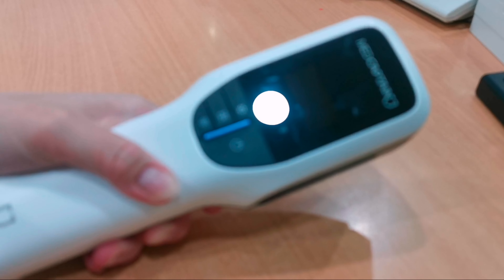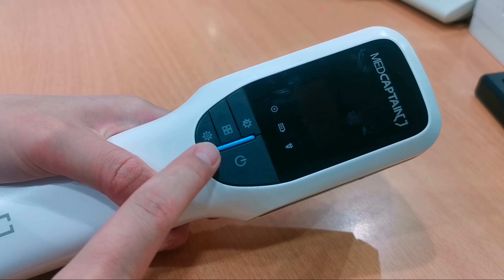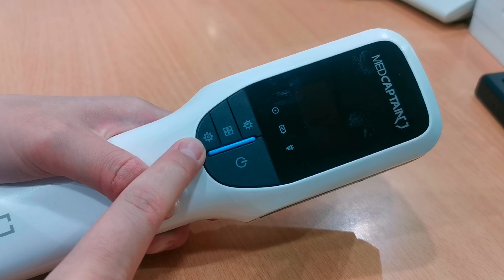Let's see what is inside the box of the MedCaptain Vein Illuminator. This is the device, and it has four buttons: the power button, the mode button, the size button, and the brightness button.